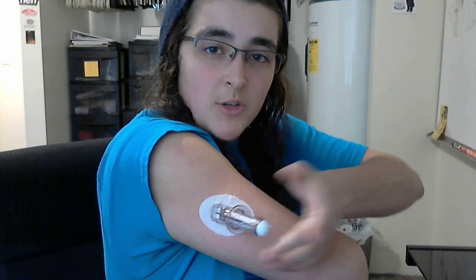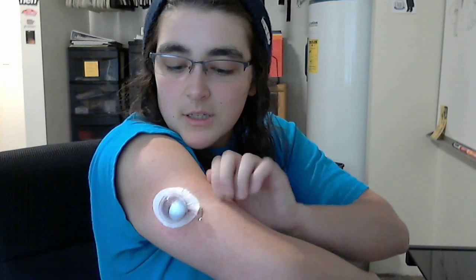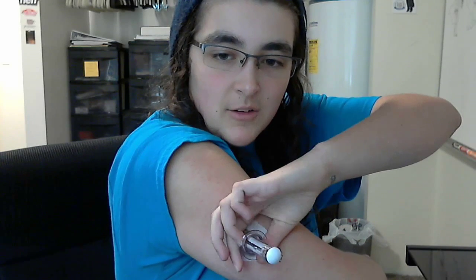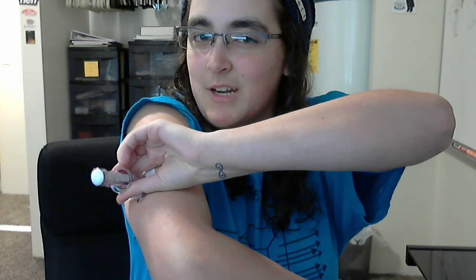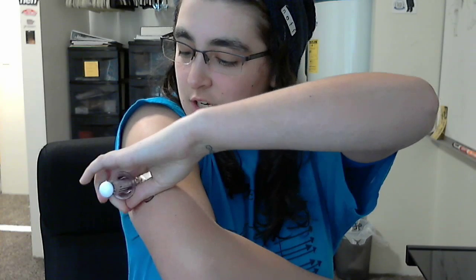And the hard part when you're doing this on your stomach, it's easy to hold it down and pull it out with 2 different hands. With one hand it can be a bit more tricky. I normally grasp it and push it down and then force it up with my fingers here. And so my hand is pushing down, my fingers are pushing up. So you're going to kind of hear that click as it's pushed up. Sometimes it can be a bit of a challenge.